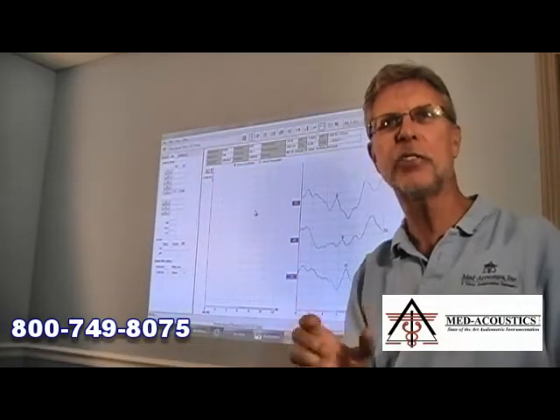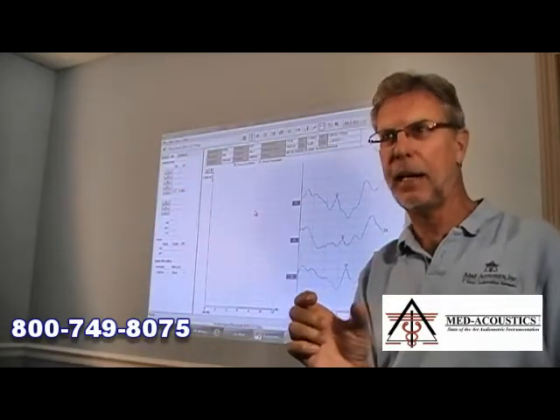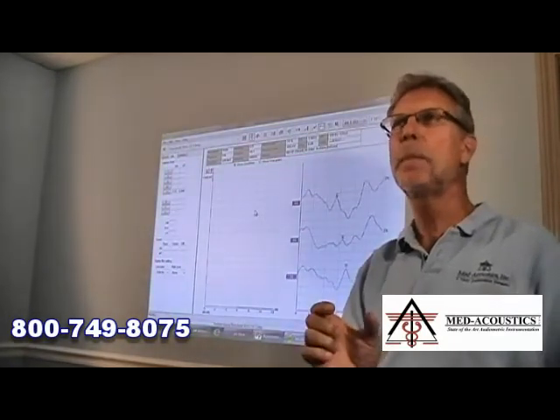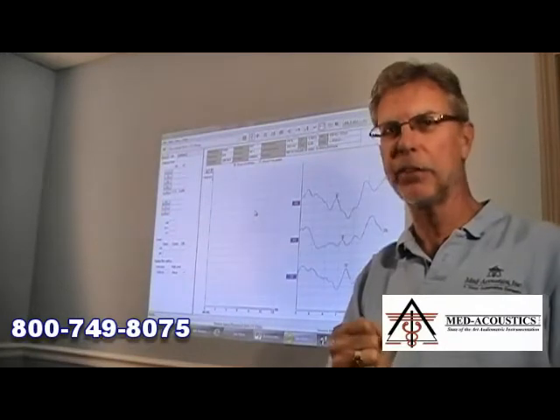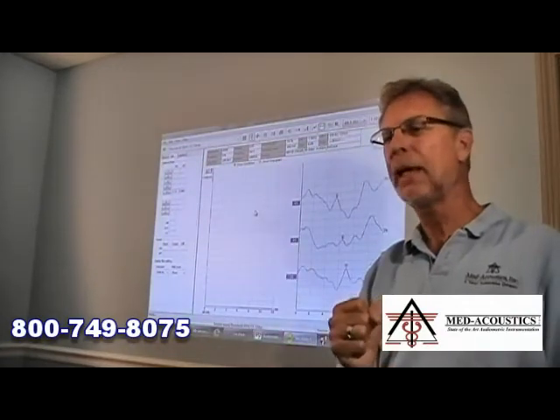It's 53 to say 62% sensitivity when patients are not having an episode. You know that this condition is episodic. So you almost have to tell the patient, well, call me when you're having an episode, and then run down here in the ambulance so we could test you during the episode. Well, since that's not practical, many ECOG tests are done when the patient is not having an episode. And so you have a poor sensitivity to actually finding this pathology with it.